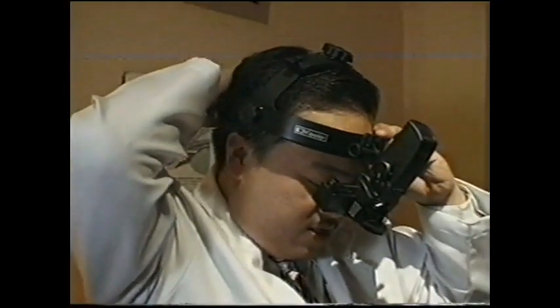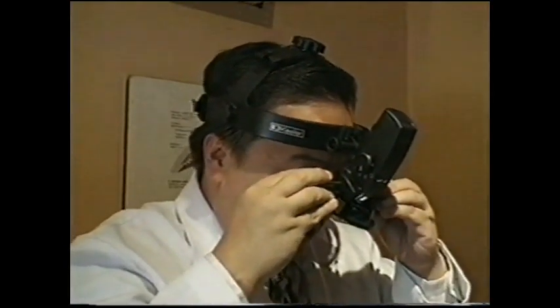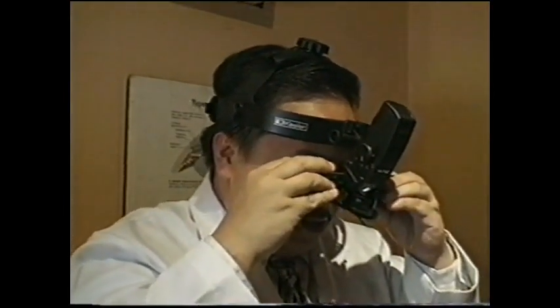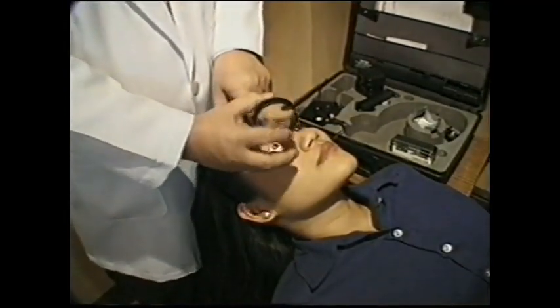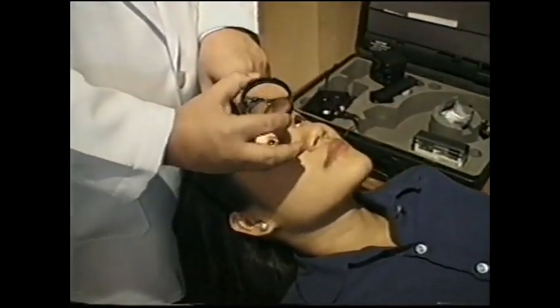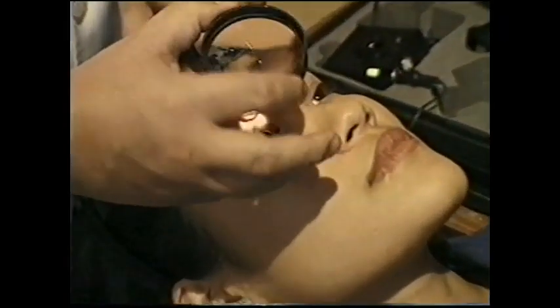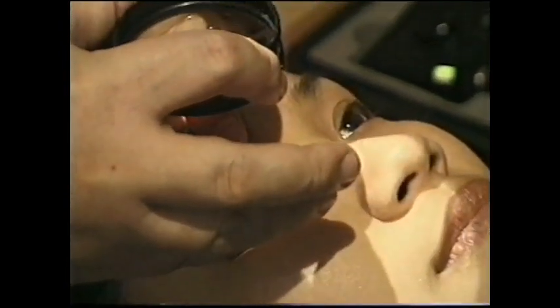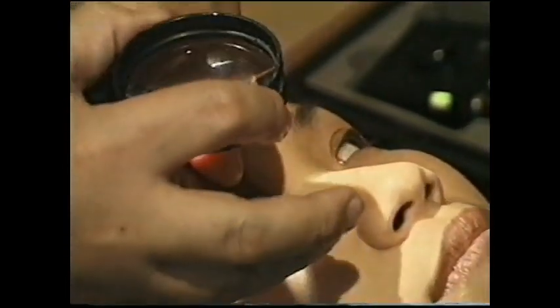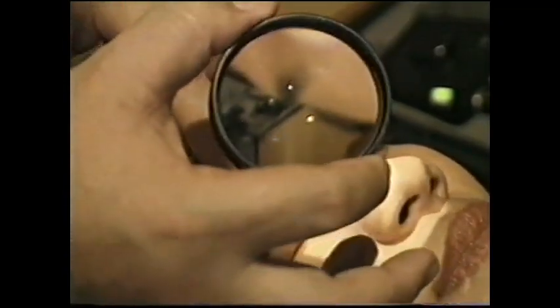The headset should be positioned comfortably on the examiner's head. The eyepieces should be situated as close as possible to the examiner's eyes, perpendicular to the pupillary plane without touching the bridge of the nose. Adjust the interpupillary distance of the oculars to allow the examiner to have a comfortable binocular view. The light beam should be adjusted vertically until the light beam occupies the upper half of the field of view.